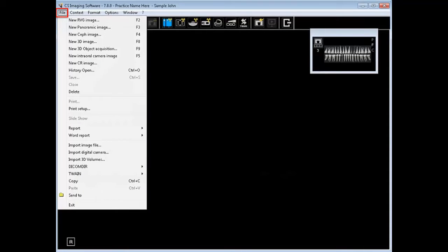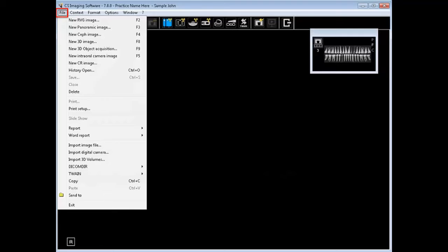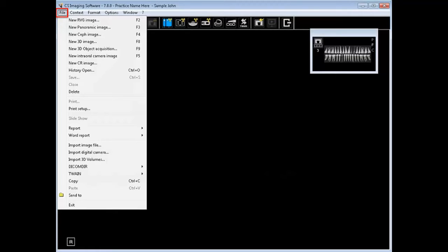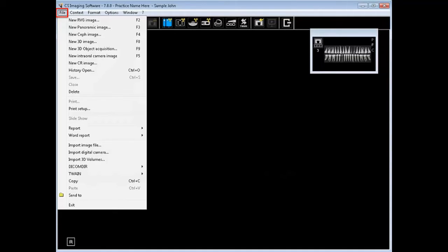From the File menu, you can acquire images from various sources, such as Sensors. This one's labeled New RVG Image. RVG stands for Radio Visiography. New panoramic images from a CareStream pan unit. New CEF. New 3D image, cone beam scan or object. Intraoral camera. Phosphor plates labeled New CR for computed radiology. You can also open history of images stored for this patient from the File menu. We will review other options such as saving and deleting and the other file functions in their respective sections. Notice the last choice of the File menu is to exit the software.